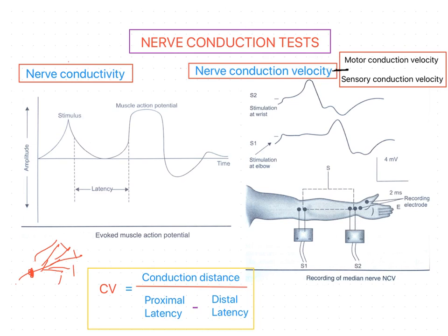One of the disadvantages of this nerve conductivity test is that it does not show whether the fault lies in the nerve or in the muscle itself. When a nerve fiber is degenerating, conductivity is lost distal to the lesion within a few days, and this can give some indication of the state of the lesion and possible prognosis before the full test can accurately be performed.